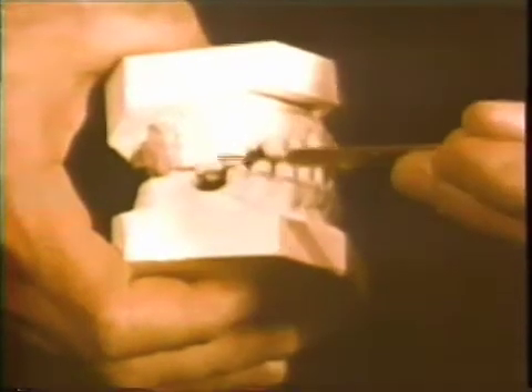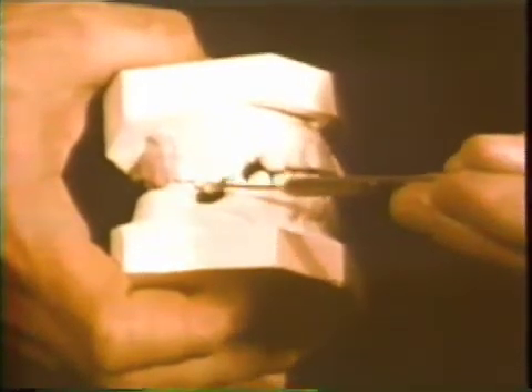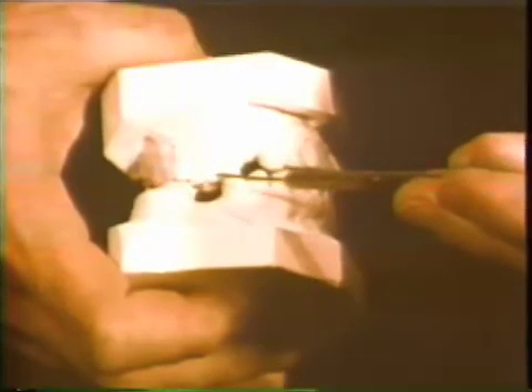The maxillary first molar has extruded into the opposing space. This radiograph shows the preoperative view of the area. There is a defect on the mesial surface of the right central incisor, which appears to be of infrabony character. This radiograph shows the donor site for the autogenous bone. The area is just distal to the maxillary right canine, where the alveolar process ascends on the distal surface.